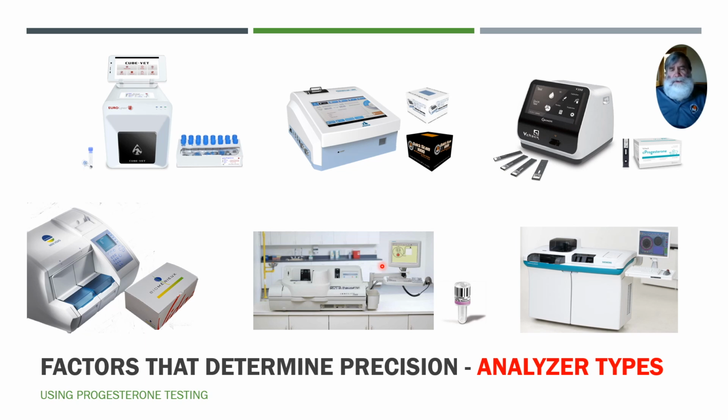They're very precise and very automated, so there's very little human interaction. Once you put the sample on, you program in your patient, hit the button, and it runs by itself. All the pipetting, mixing, and incubating is done automatically. Now a machine will do repetitive mechanical actions much better than a human being. I think we'd all agree with that. So that's usually where the precision comes in. There are other things involved, but that's the main thing.